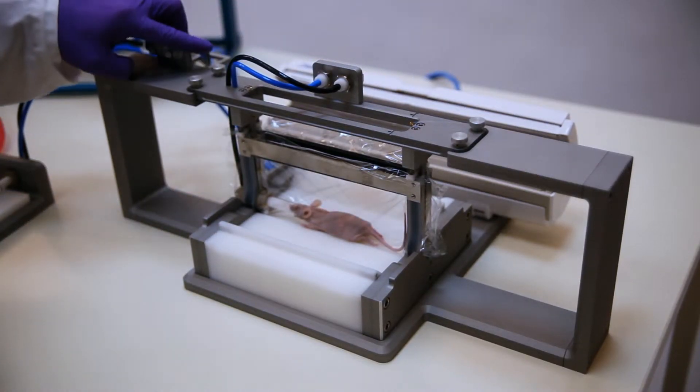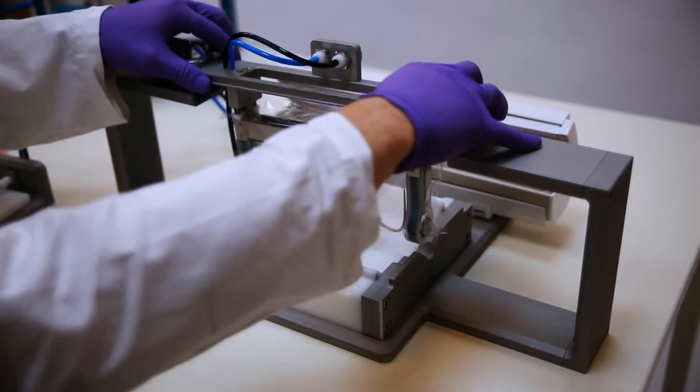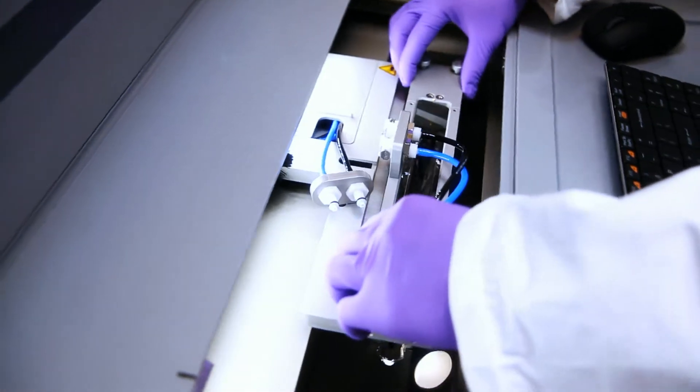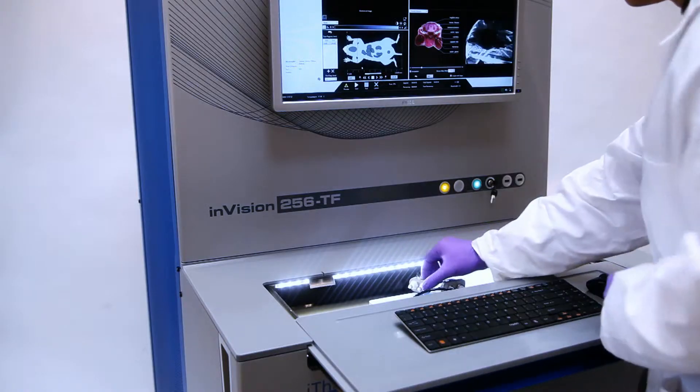Anesthesia is disconnected from the preparation station and the animal holder is transferred to the imaging system. The holder is placed into a tray inside the system's imaging chamber.